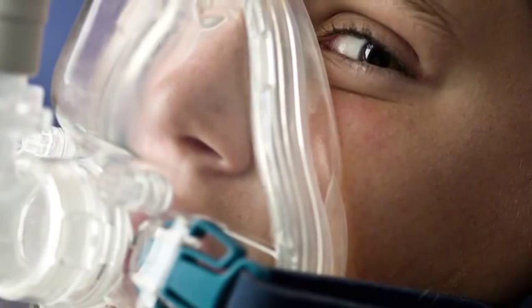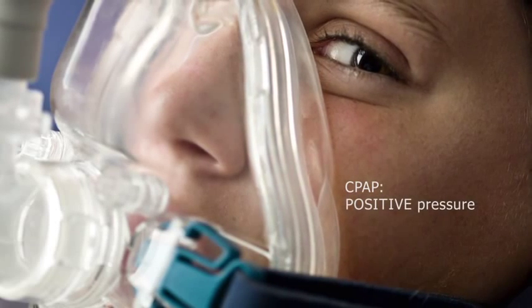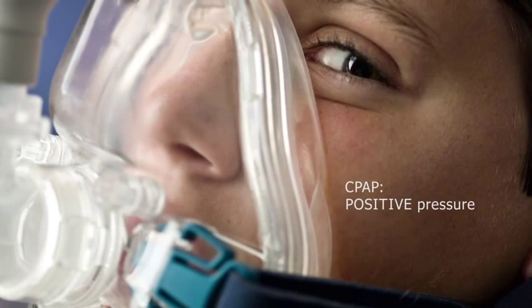Think of IPR therapy as the opposite of CPAP, which delivers positive pressure to patients with congestive heart failure in order to drive fluid out of the lungs and lower blood pressure.